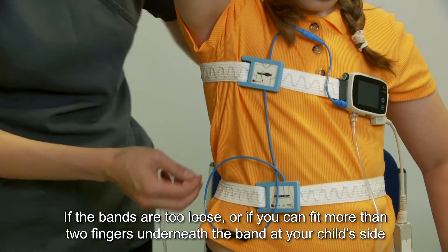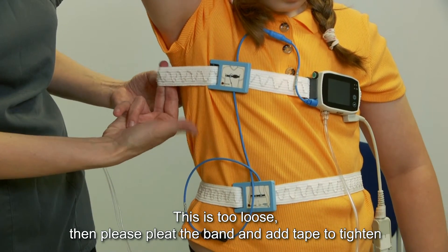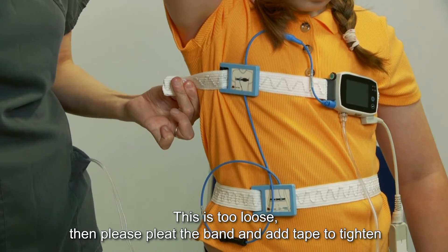If the bands are too loose, or if you can fit more than two fingers underneath the band at your child's side, they are too loose. Please pleat the band and add tape to tighten.